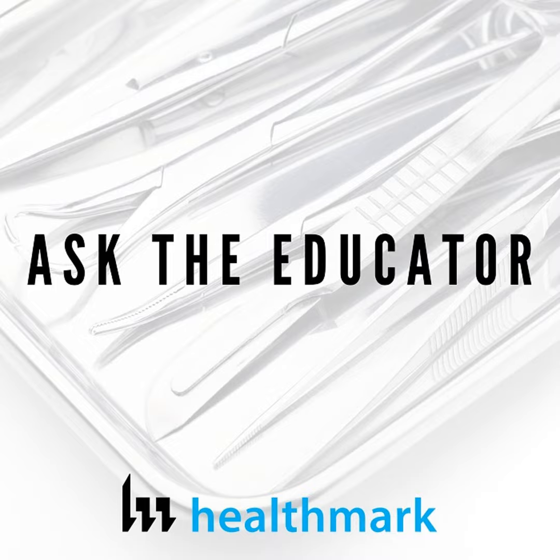And the fact that some of these folks are investing in the proper inspection equipment further illustrates the point that you just brought up about the proper brushes. So it's like a three-pronged approach, I believe: one is the training and following the IFU, two is having the proper inspection equipment, and three is having the proper brushes. So there's a three-pronged approach to getting these things clean. And hopefully people are starting to understand that.